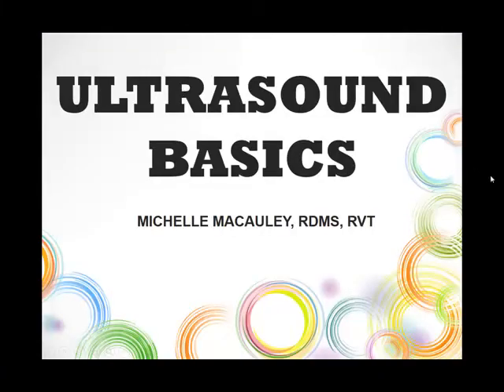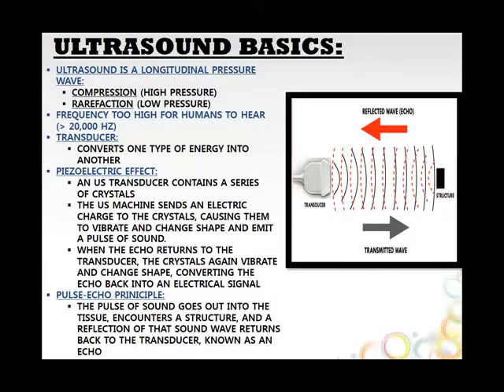Okay, so ultrasound basics. Very important. So what is sound? Ultrasound is a longitudinal pressure wave. It has areas of high pressure and low pressure. The areas of high pressure are called compression, and the areas of low pressure are called rarefaction.